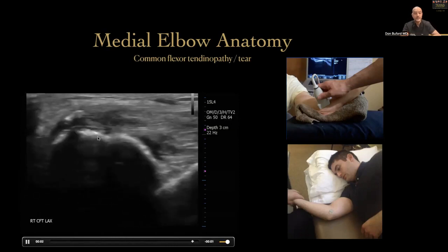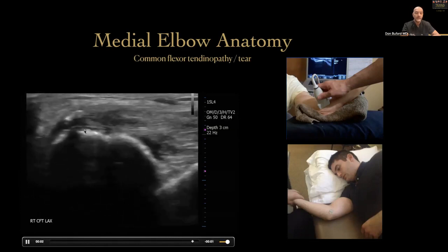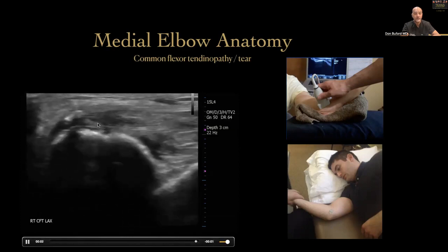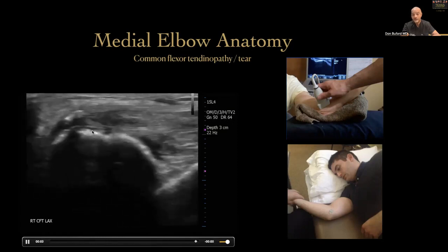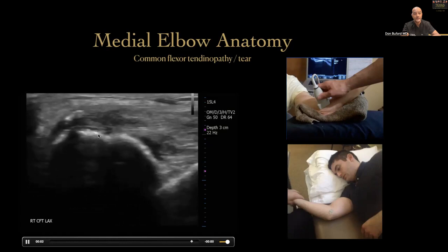And then you put the ultrasound on the elbow and you see what looks like, yeah, it could be normal, maybe not. But if you're not sure, look at the other elbow that hopefully doesn't hurt. And you'll see that this appearance will be quite different from the other elbow that's not sore. This appearance will be darker. It'll be thicker on average if it's a relatively acute symptom. And that side-to-side difference when you don't have a lot of experience really helps you make the diagnosis.